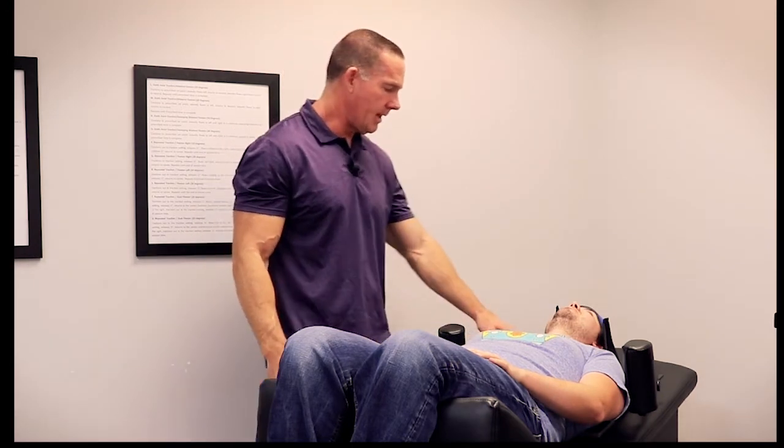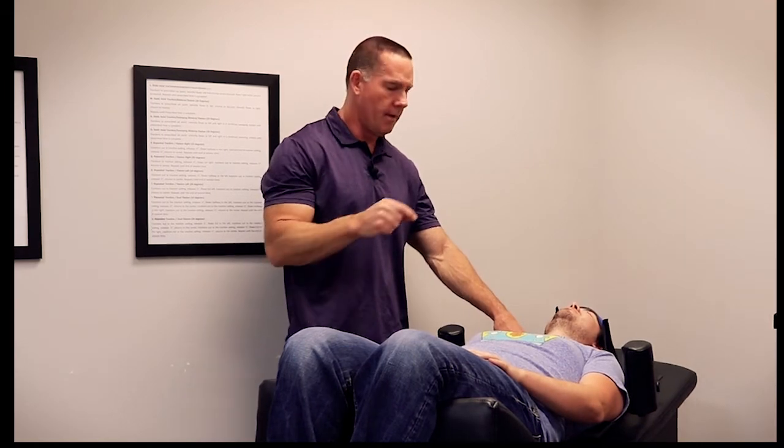You comfortable? This is going to pull him out and hold, and it'll let off a half inch. As you can see, it's just a very slight, gentle pull. I'll put a protocol list on our online resource service for correcting reversal of the cervical curve — we've seen correction in as little as 12 visits. We use this with a couple of halo posture weights and some exercise in the office to make that total correction in about 12 to 14 visits. I'll show some pre and post X-rays on that as well.